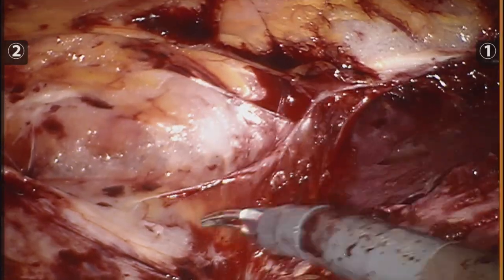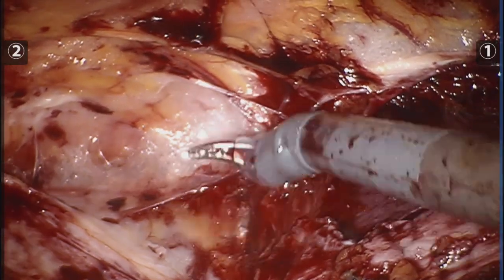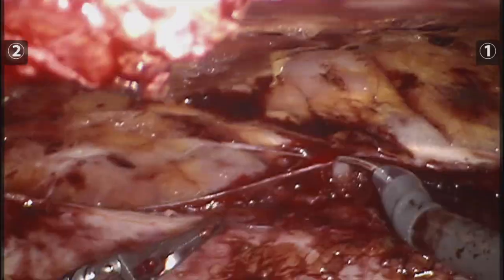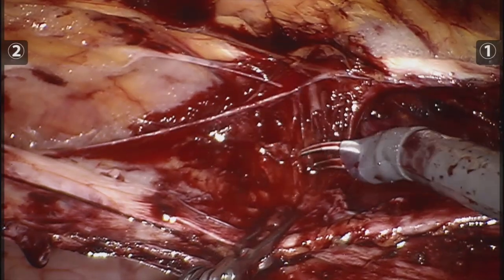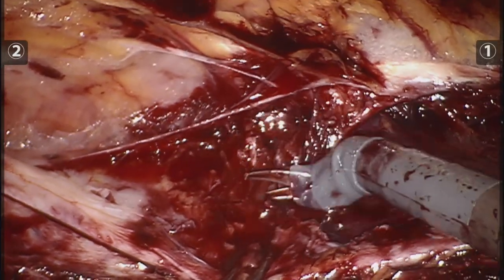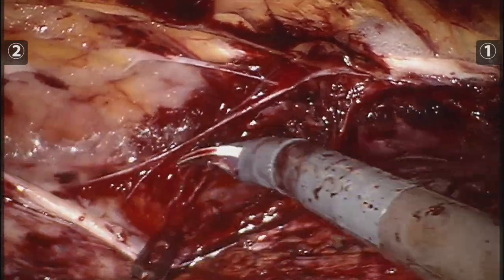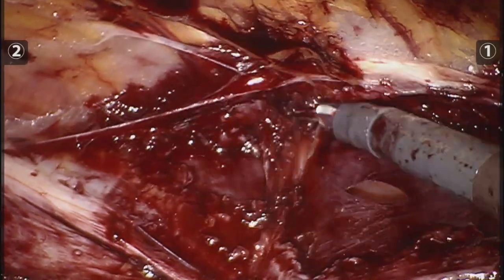As I carry on with the procedure I get to the part of the transversus where the muscle fibers are a little thicker, so it becomes more bloody and a little more difficult to see the plane — but it was very important to remain calm and try to follow my proctor's directions.